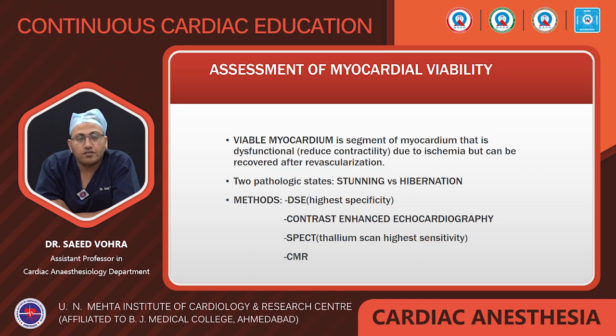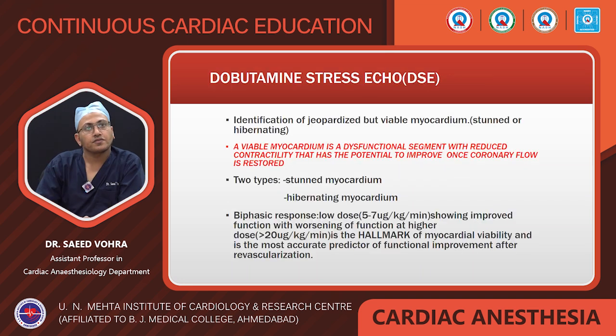Now, to assess the viability of the myocardium, the commonly used methods are dobutamine stress echo, which has the highest specificity; contrast enhanced echocardiography; single photon emission computed tomography, in which the thallium scan has the highest sensitivity; and fourth, cardiac magnetic resonance.